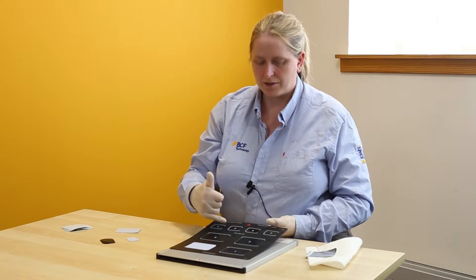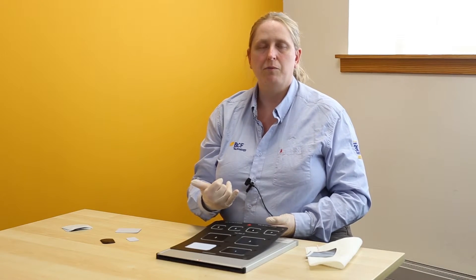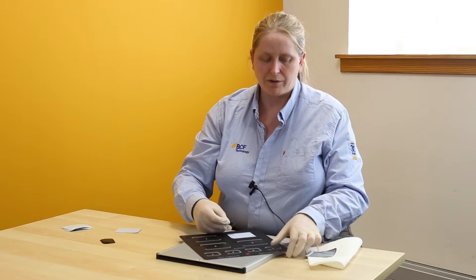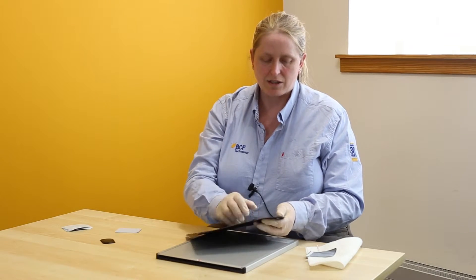You will notice there are 8 slots on here so you can actually process multiple cassettes or multiple screens at the same time. But the thing to remember if you are loading them all in is just to make sure you don't then leave this sat on the side, because it will fog.